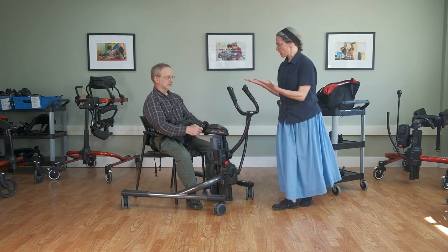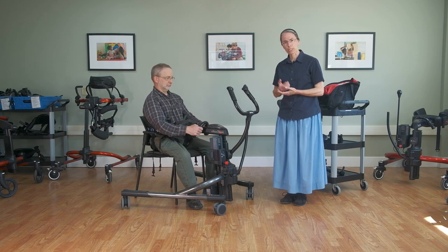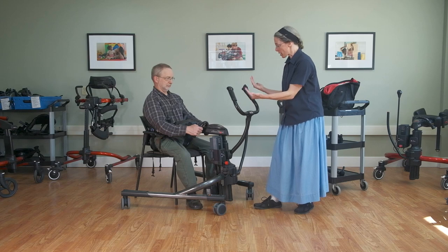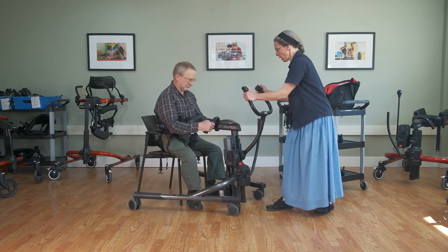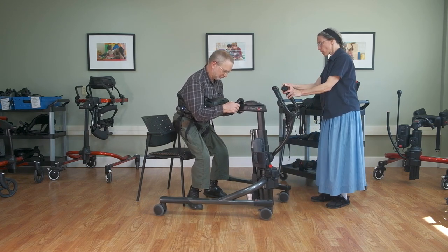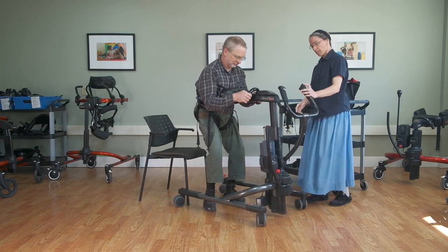What we're looking for as I bring him up into a standing position is essentially shoulders over hips over knees over feet. We want to avoid a posterior tilt of the pelvis and flexed paddling of the limbs — aim for more anterior tilt of the pelvis for good walking. As I bring him up to stand, I draw the device forward, encourage weight bearing through the feet, encourage a forward leaning position, and get him supported into standing. It moves quite slowly so you can monitor how it's doing, then close the base legs and encourage the walking.